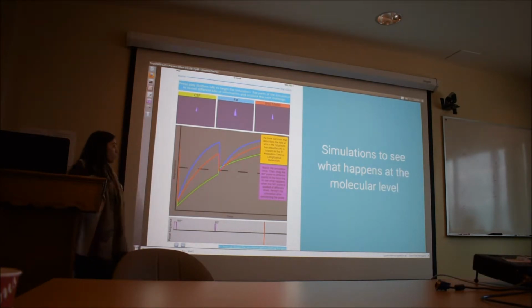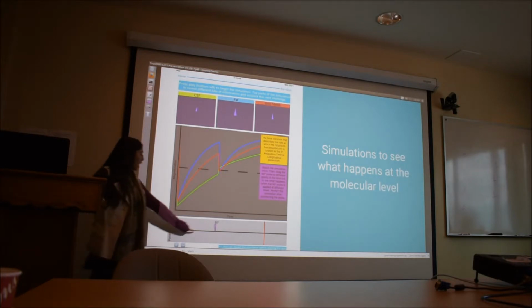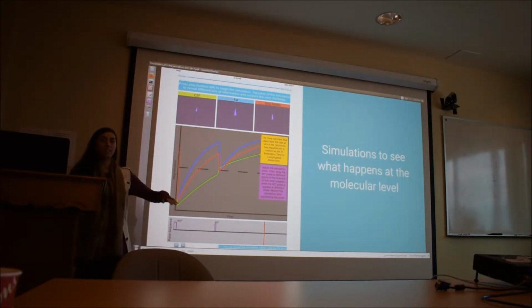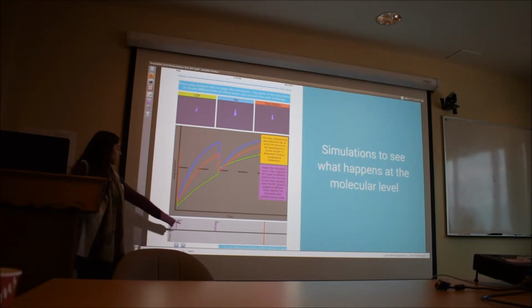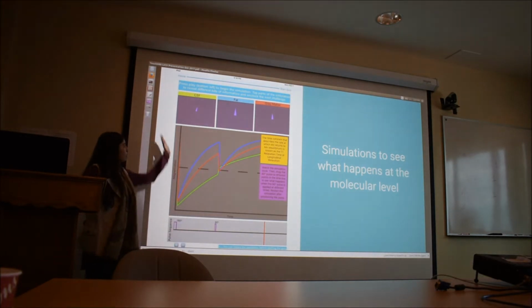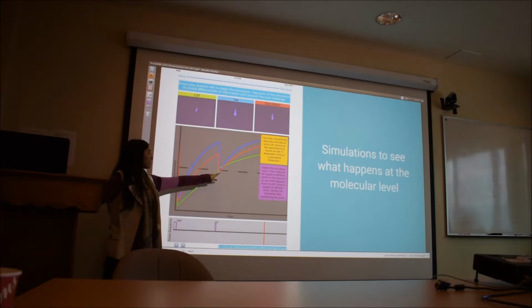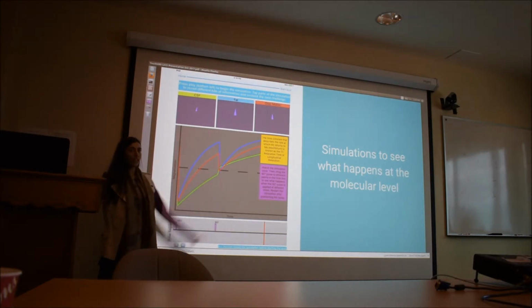And so how do we get a signal, and how do we get a picture from that? What happens is you apply a 90-degree pulse to tip the cones into the X and Y plane, and the magnitude of the vectors in the X and Y plane corresponds to the magnitude of the signal. Once the 90-degree pulse is applied, the cone tips down from the z-axis, going down to the 0 value.